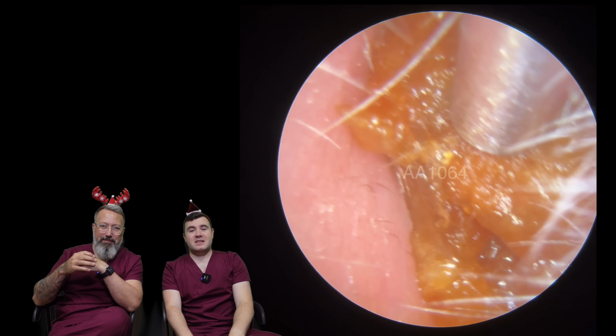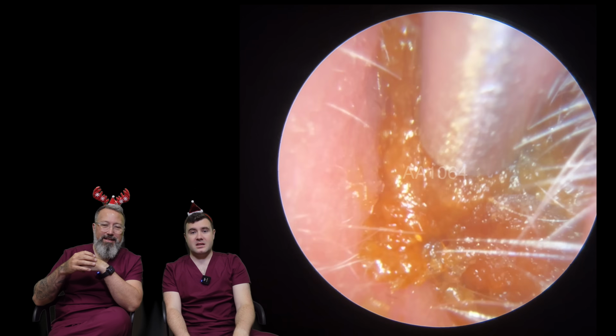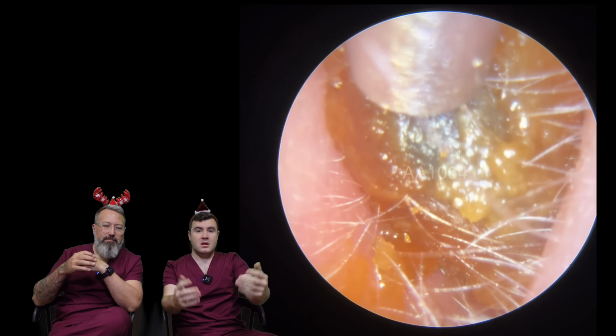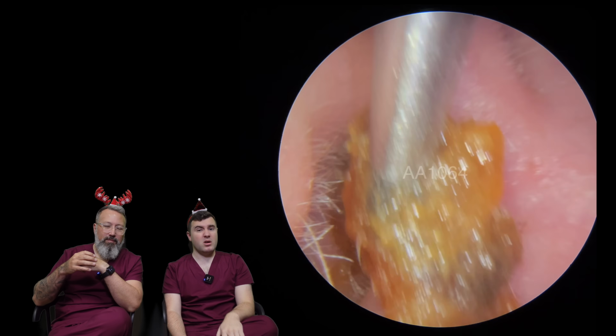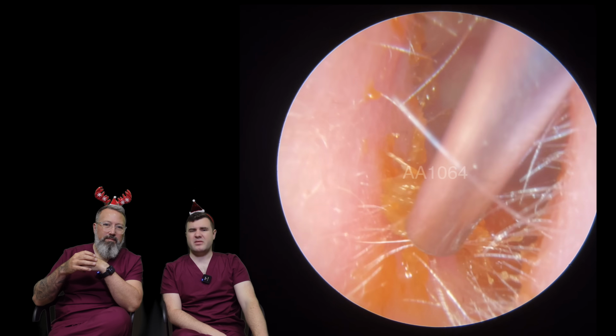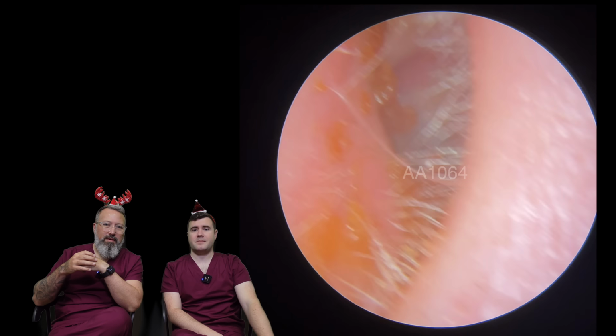So this is, like I said, the first day, guys, and it's a nice, quick, easy one to get you started off with. We just got a smallish piece of wax that wasn't really blocking up the ear canal, but the patient was getting a lot of itching, having a sensation that something was in the ear.